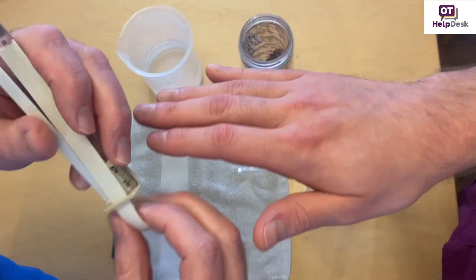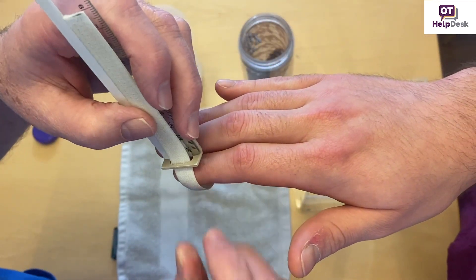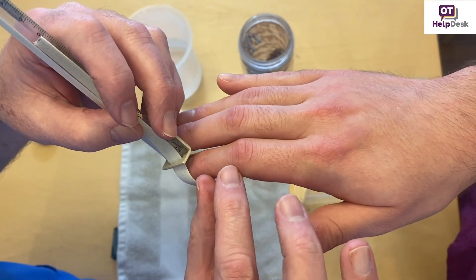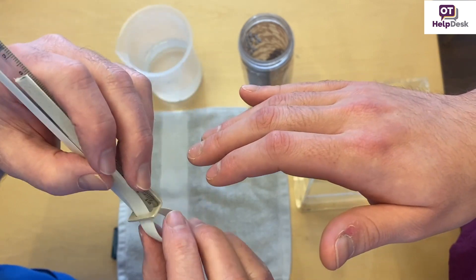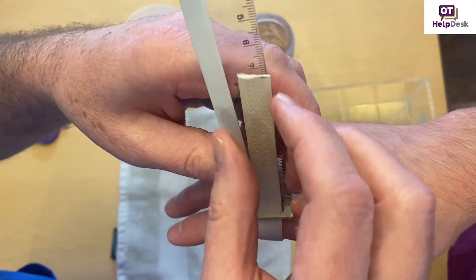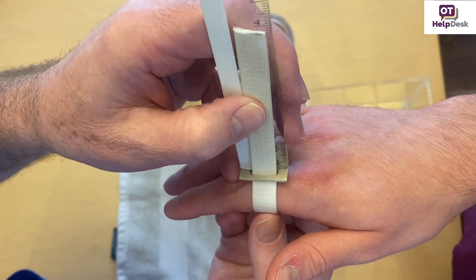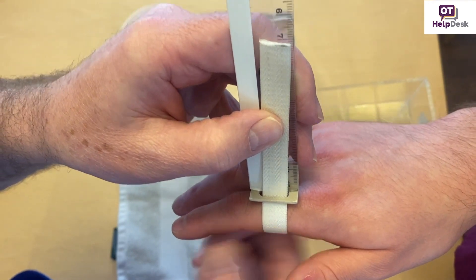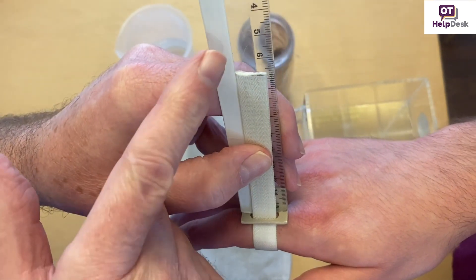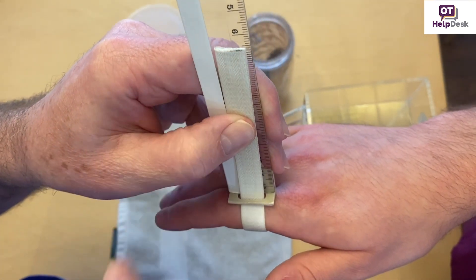The next thing we're going to do is measure the proximal phalanx, the middle phalanx, and the distal phalanx on each hand. The way we do that is we're going to use basically a ring sizer, and this is what measures edema. You bring it around like so, then you pull it. You can see that right now he's about 6.4 for that proximal phalanx.